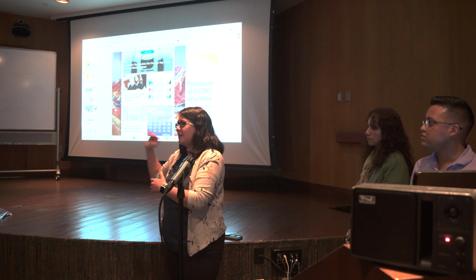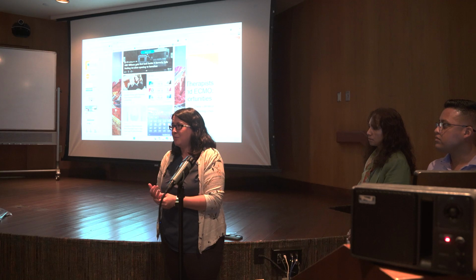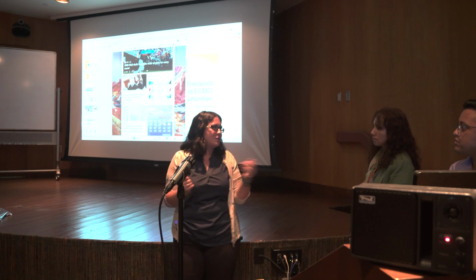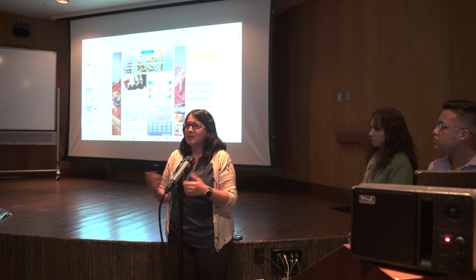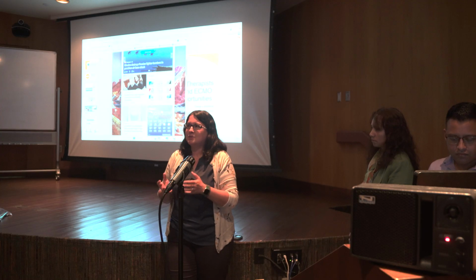And I can say, okay, this is what I did today. Look at this. This is why I don't really want to go down on the PEEP. Because as you said earlier, chest x-rays are a snapshot and they don't show everything, like whether pneumonia is improving or getting worse. And so having something that can capture that in real time for us, that's gold.